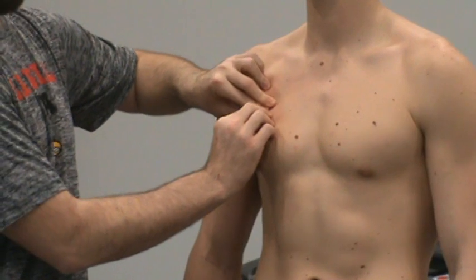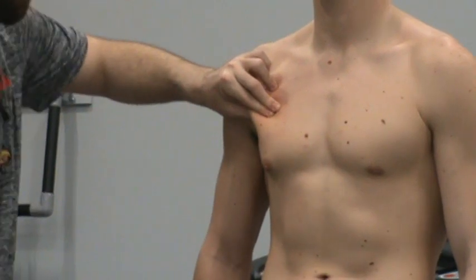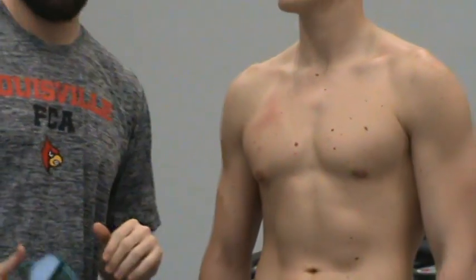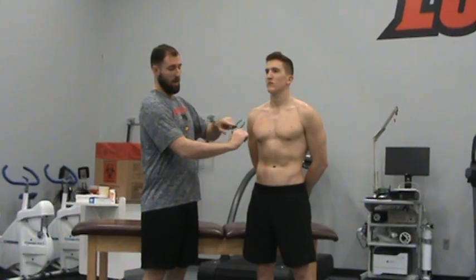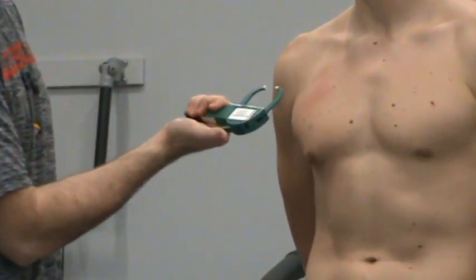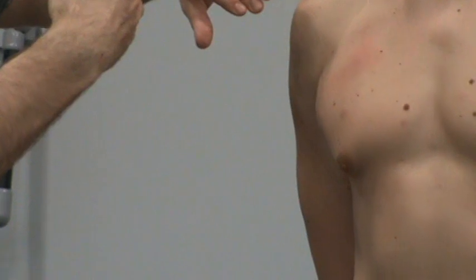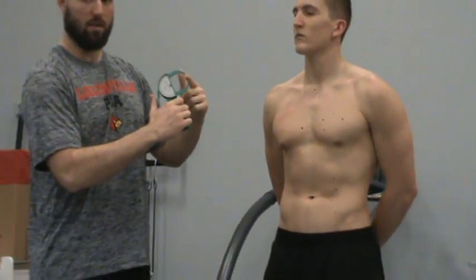I'm getting that part up — he's really uncomfortable, but that's too bad because I want to get a good reading. Once I have that, I take one hand away. I've got a good pinch of skin. Then I take my calipers, get my reading, and pull away. I always want the numbers facing up so I can read them. I go in, pinch, let go with my thumb, and get my reading. I only hold it for about a second because the longer you hold it, the more the skin is going to compress in.